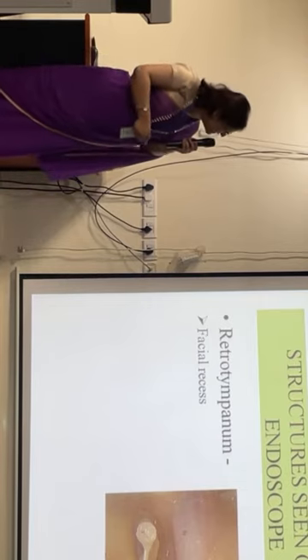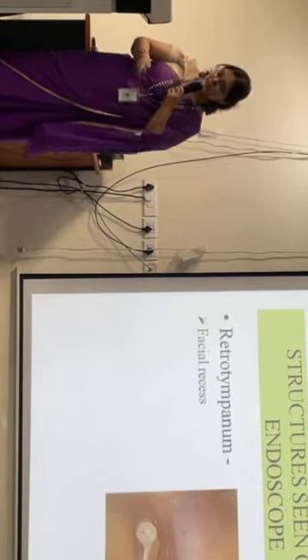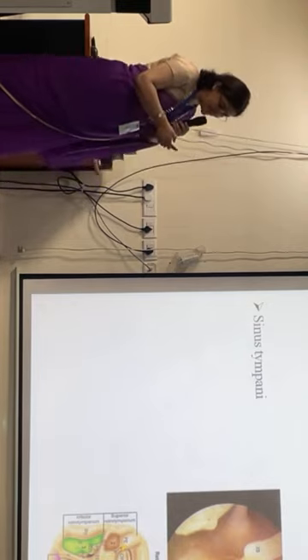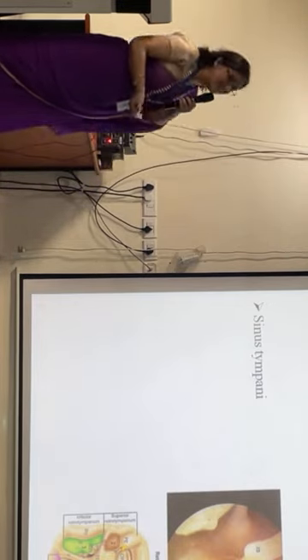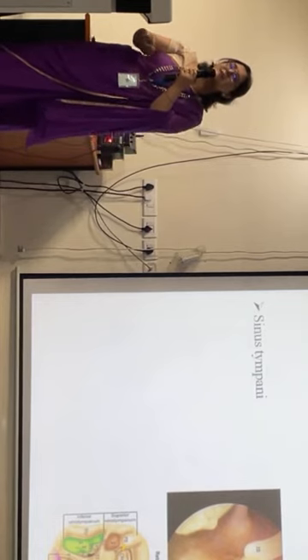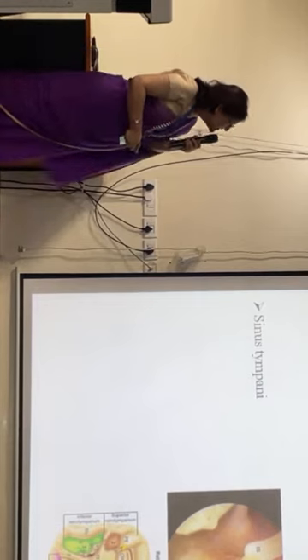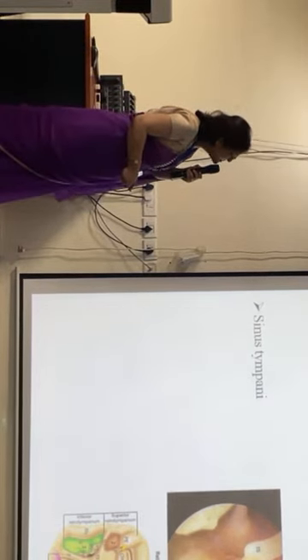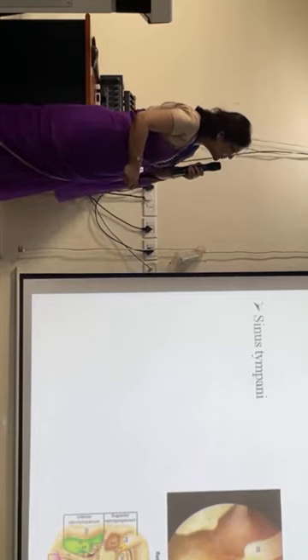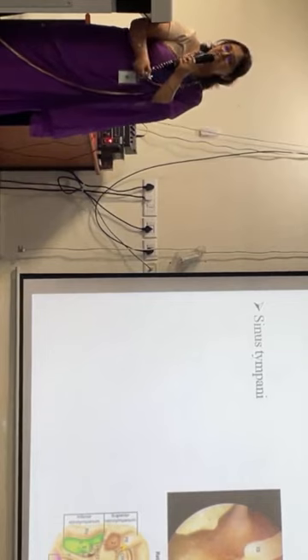If it is under vision, we will remove the disease to the wound. Then the other area that is important is the surgeon's graveyard, the sinus tympani. If we leave disease here, this is the commonest place where residual disease is left behind. If we see the sinus tympani in an endoscopic view, we are sure we will be able to approach it and remove the sinus tympani cholesteatoma under vision.